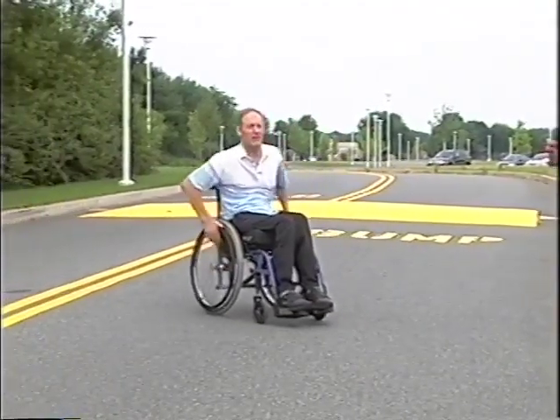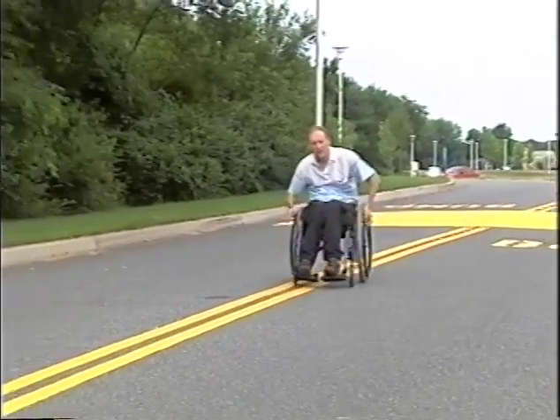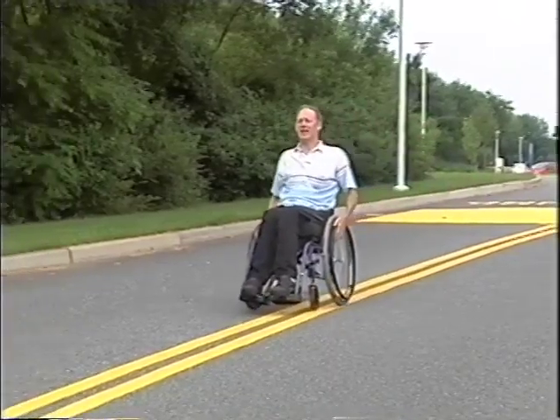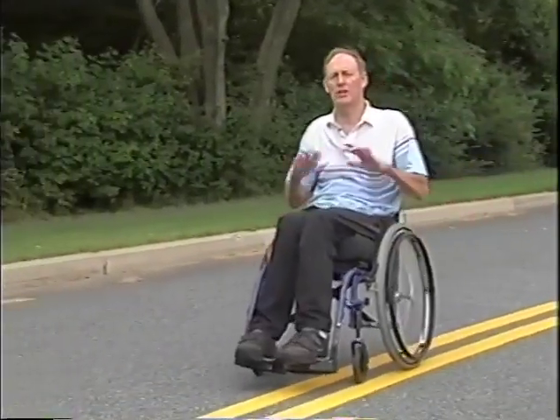And so you're going to have to fight that. And if you're going a long distance, it's going to add up. You may want to think about getting on the crown of the road, putting a wheel on each side of it, and then leaning back and letting the road actually help you. You'll go straight because one wheel is going to the right, one wheel is going to the left. So it can be very helpful if you're going for a long distance.